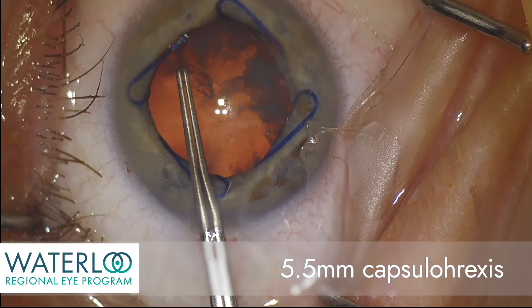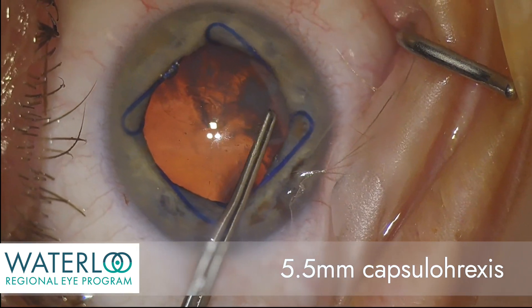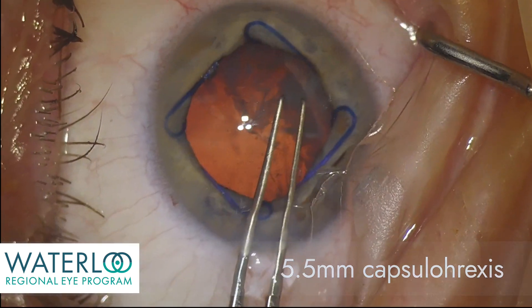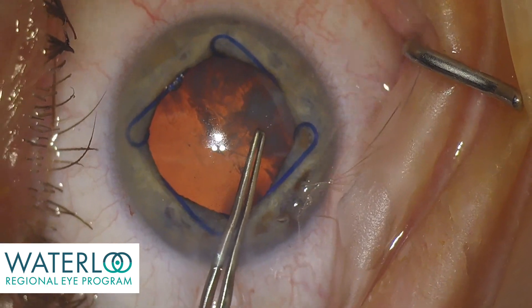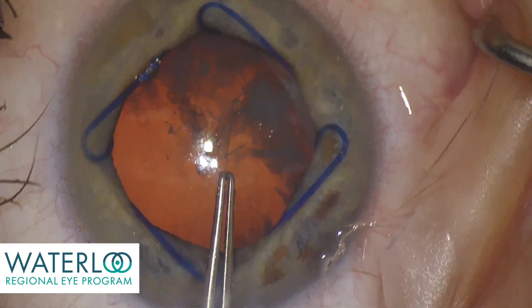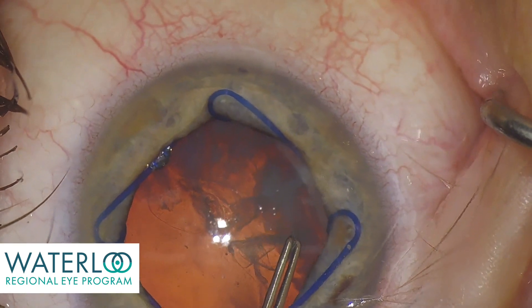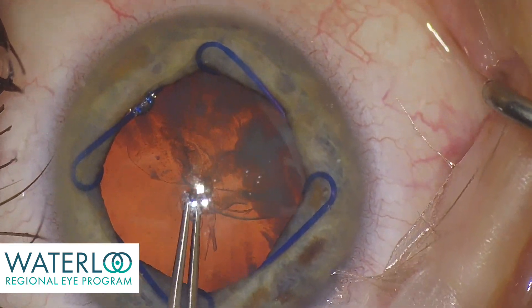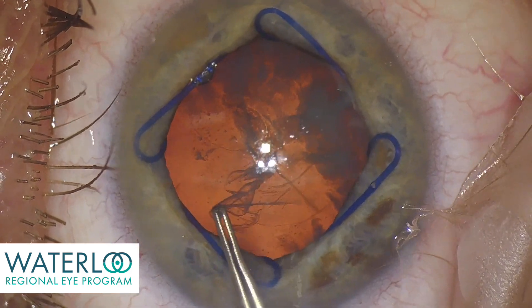Now a capsulorhexis can be completed. Here it is being completed manually with capsulorhexis forceps. This is a circular opening in the front of the capsule that allows the surgeon to access the cataract without disrupting the support system into which an artificial implant will eventually be inserted. The capsulorhexis size is ideally 5.5 millimeters.